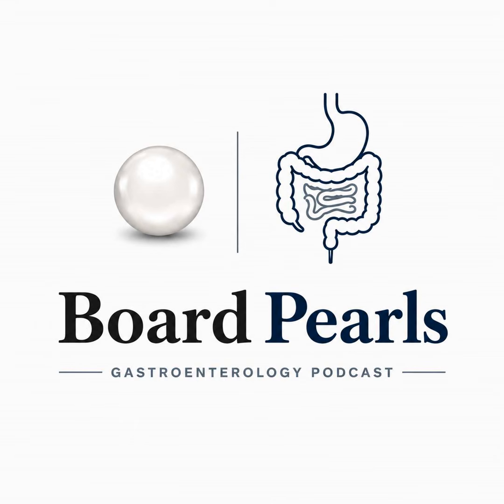Now the hilum, and here, one of those design choices reverses, which is exactly the kind of flip a stem will probe. Unresectable hilar cholangiocarcinoma, perihilar tumors, or gallbladder cancer obstruct the confluence where the right and left ducts meet, producing bilateral intrahepatic dilation. Your distal instinct says reach for a covered stent to block ingrowth. At the hilum, that instinct is wrong.